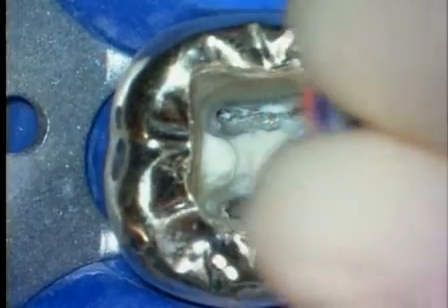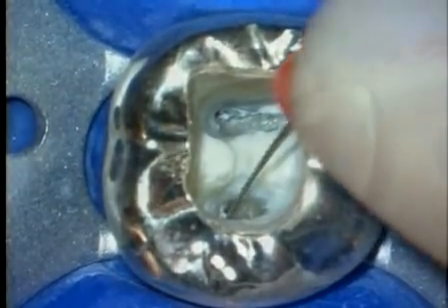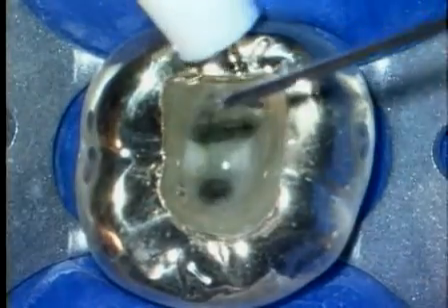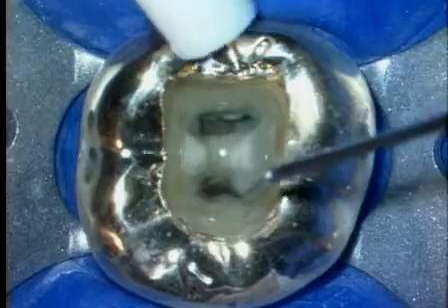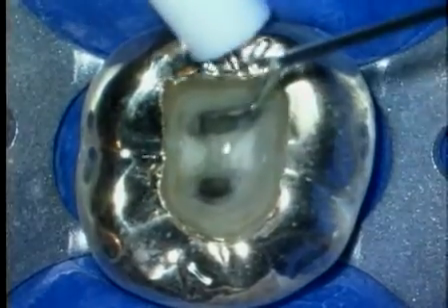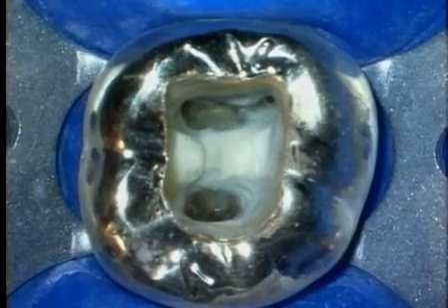When we refine our pulp chambers with ultrasonics, we set the stage for more predictable cleaning and shaping procedures. The finished access cavity can be topped off with an appropriate irrigant, and this sets the stage for scouting the canals.